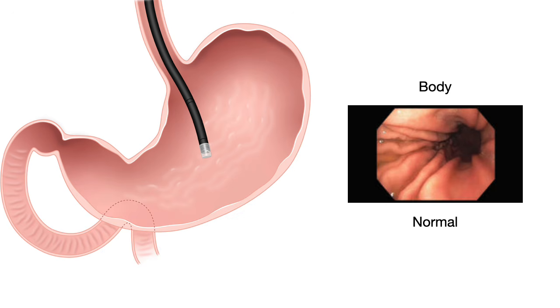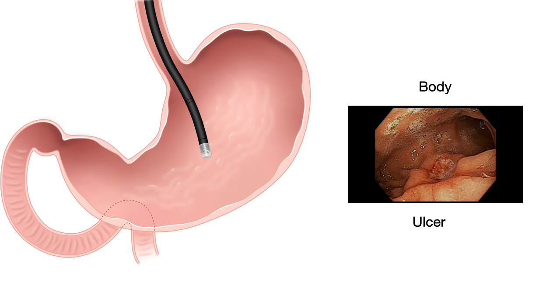Okay. So as you go down, sometimes you see ulcers where there's a break in those folds, as you can see here. There is a crater here, and there's some thickening of the fold at the edge, and the folds are converging there with a deep crater.